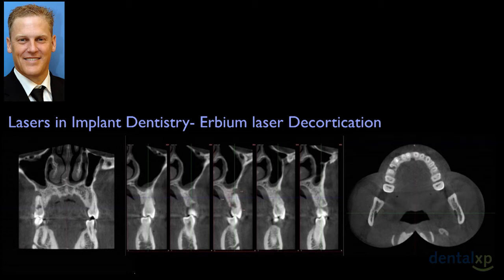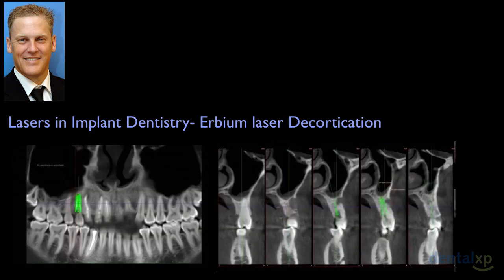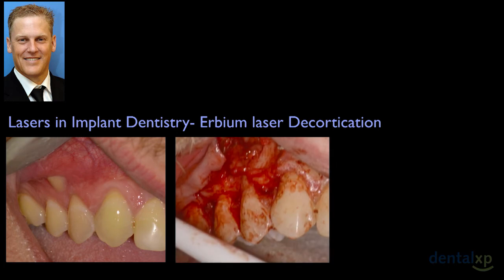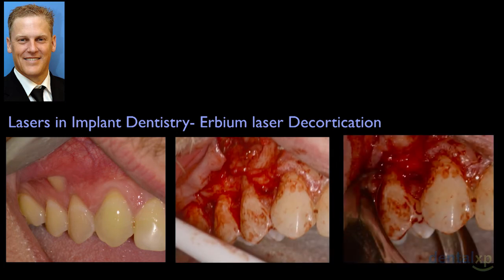This particular patient took a puck to the mouth and damaged 10 teeth. A year later he came back, and you could see the tremendous resorption that had occurred on the premolar made it unrestorable. So at this point, what we did is we tried to do an immediate implant for him, and you can see here the site is having active infection going on. A flap was raised. The tooth was simply removed, most of the buccal bone being lost.